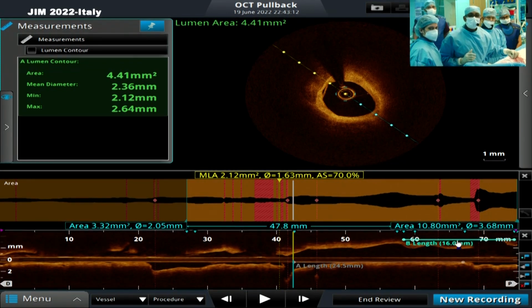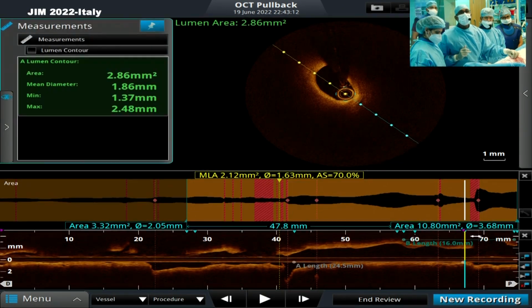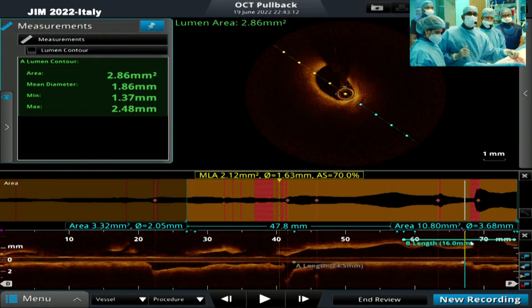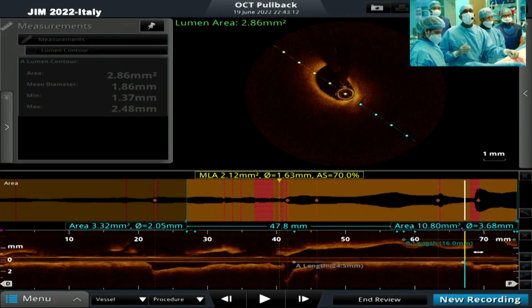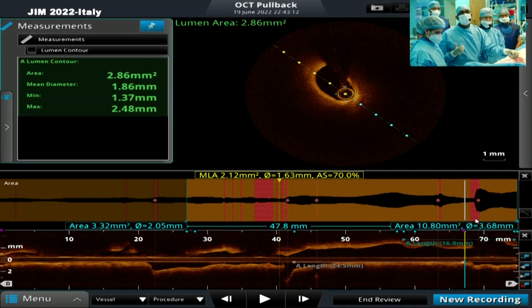Deepak, what was the left main diameter? It was 4.5. So we are going with a 3.5 Alpine stent; definitely you would be able to go more than 4.5. So that was the reason why we decided on a 3.5 stent. What is the other panelists' opinion?